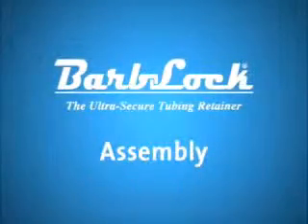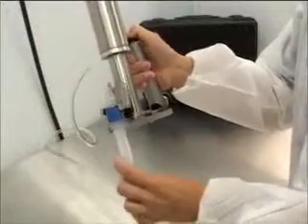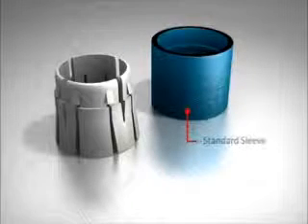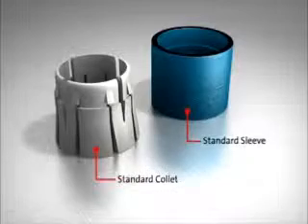Assembly. With Barblock, assembly is easy and fast, saving you valuable time and avoiding unnecessary difficulty. The retainer consists of 2 parts. The first is the standard sleeve, which is the outer layer. The second is the standard collet, which fits into the standard sleeve.